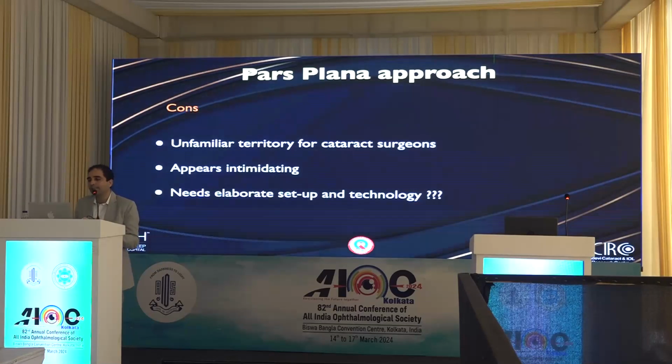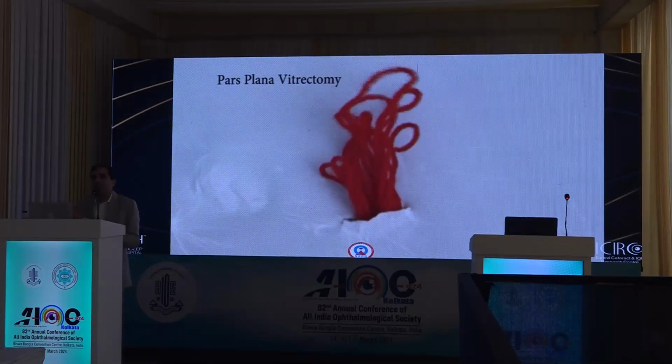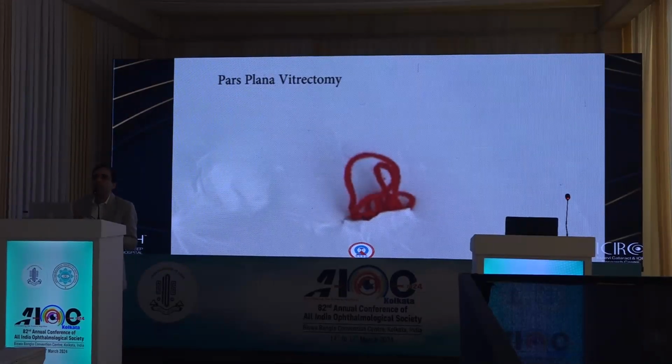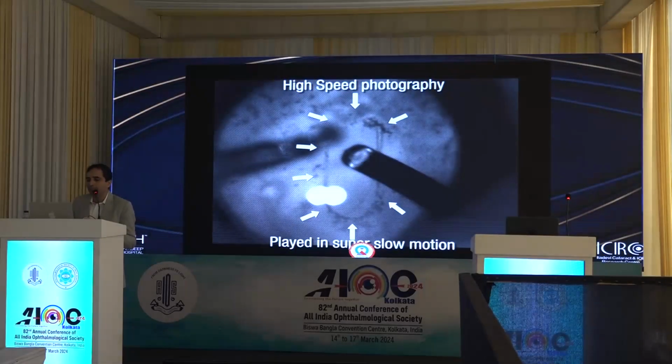capsular tear margin. Coming to the pars plana approach, we always find it intimidating that we are not retinal surgeons. How can we enter through the pars plana? Do I need separate machines, separate instruments, and so forth? Fortunately, not much is needed. The major advantage is that because we are draining the vitreous from where it is actually coming from, we are attacking a much smaller amount of vitreous, only what is required, and therefore the chances of enlargement of the PCR are lesser than with a limbal approach.